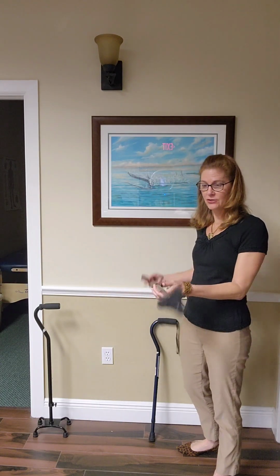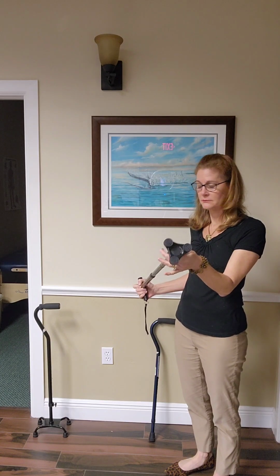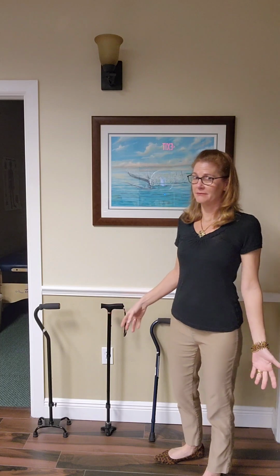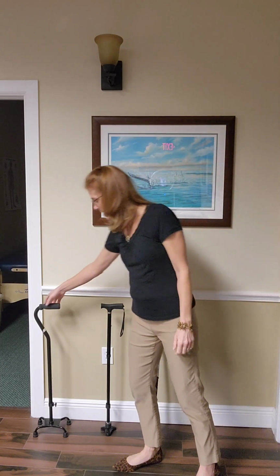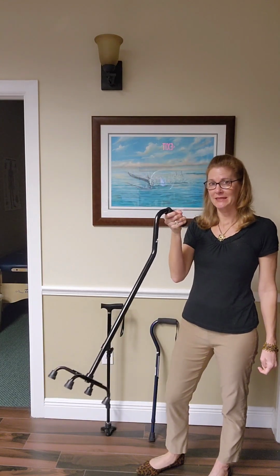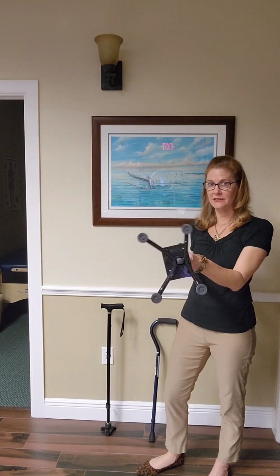Then we have a tripod cane, which stands on its own. And that's really the advantage of that tripod, as best I can tell. And then we have a quad cane. This is the cane that I recommend the least. I'll explain why in a bit. You'll notice it has the larger base.